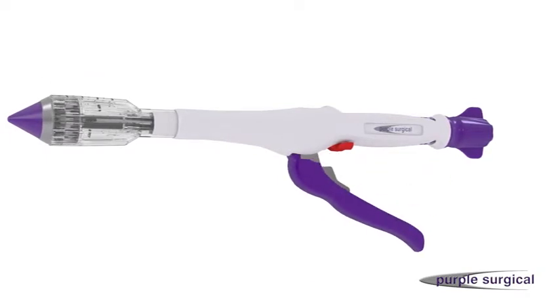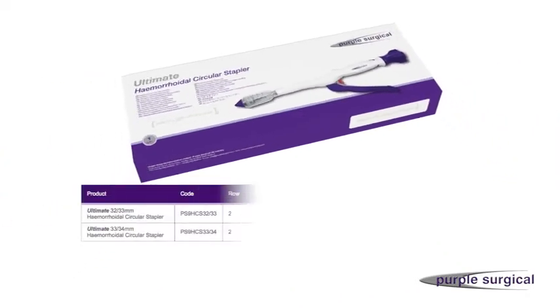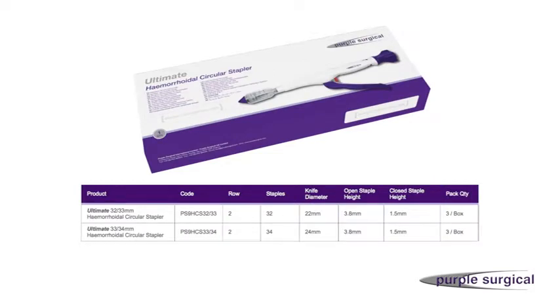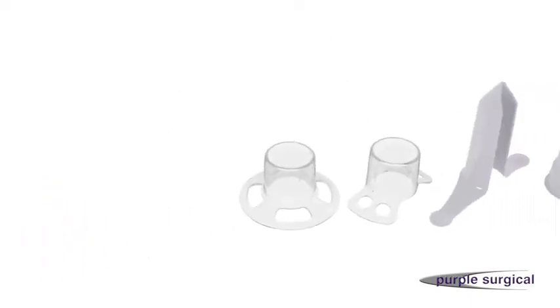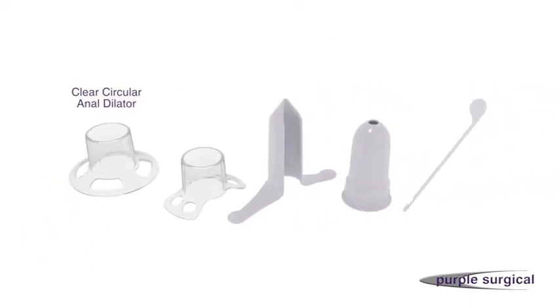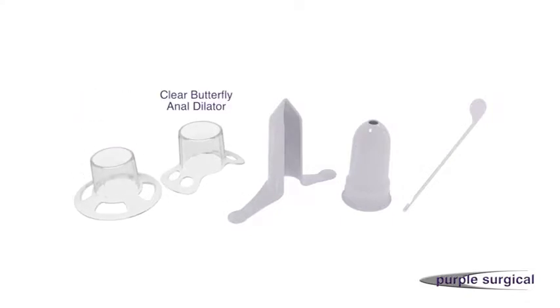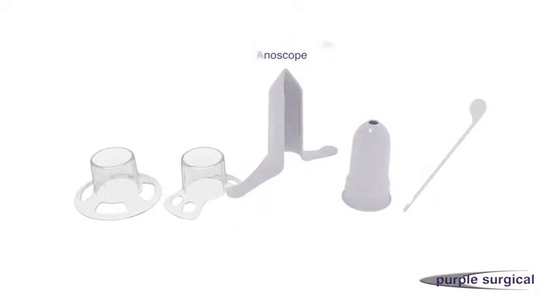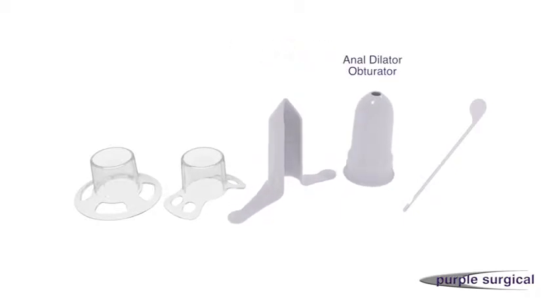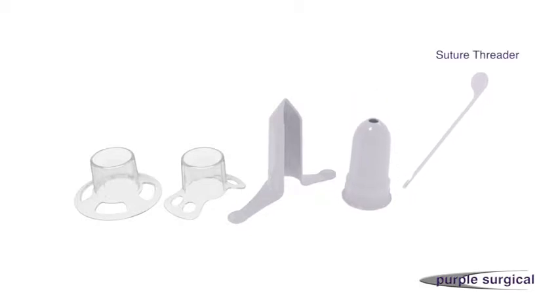There are two size options available: 32-33mm and 33-34mm. Supplied and packaged with the following five accessories: a clear circular anal dilator, a clear butterfly anal dilator, a purse string suture anoscope, an anal dilator obturator, and a suture threader.